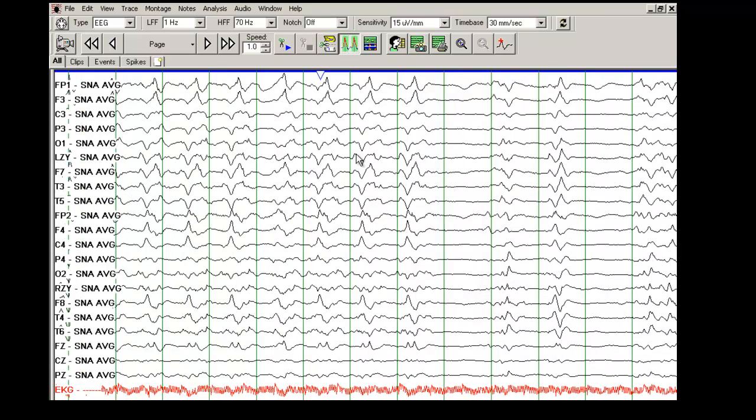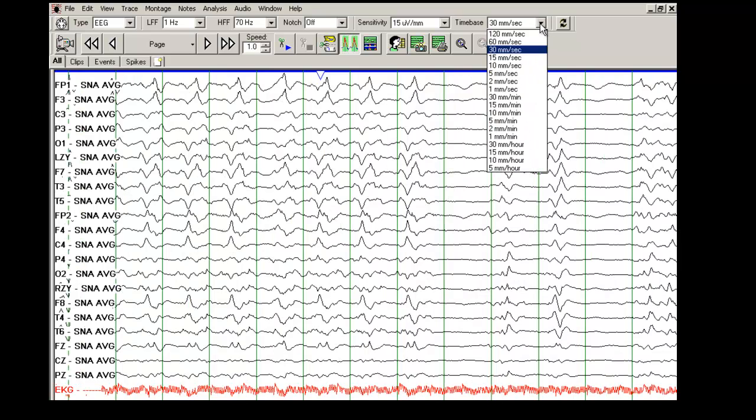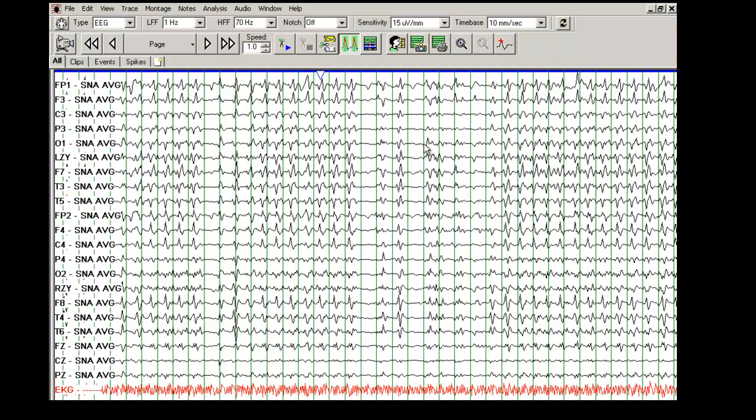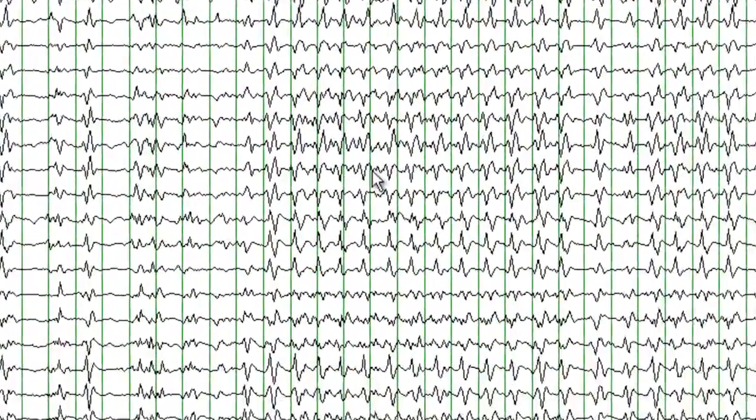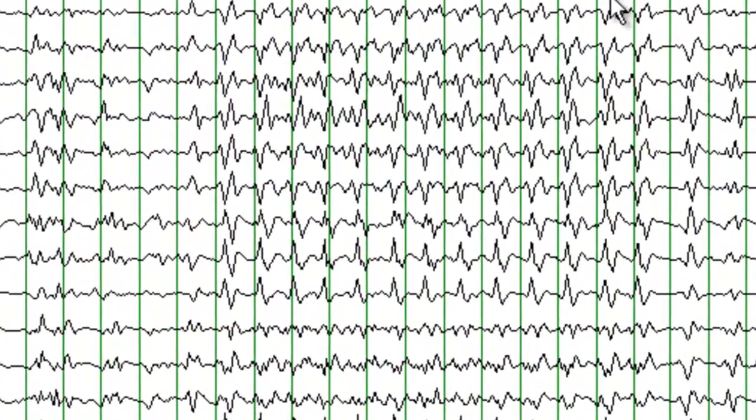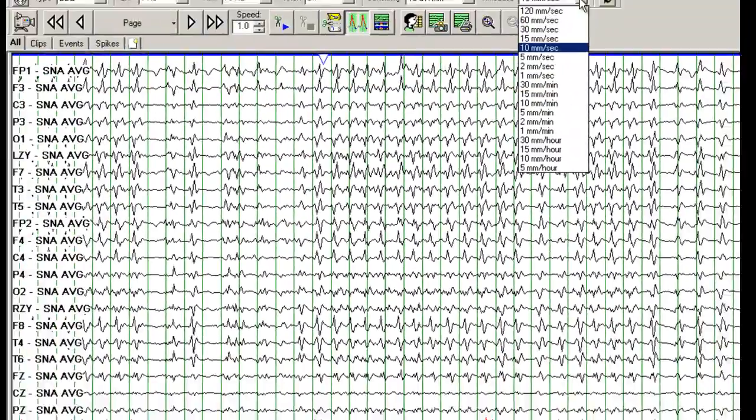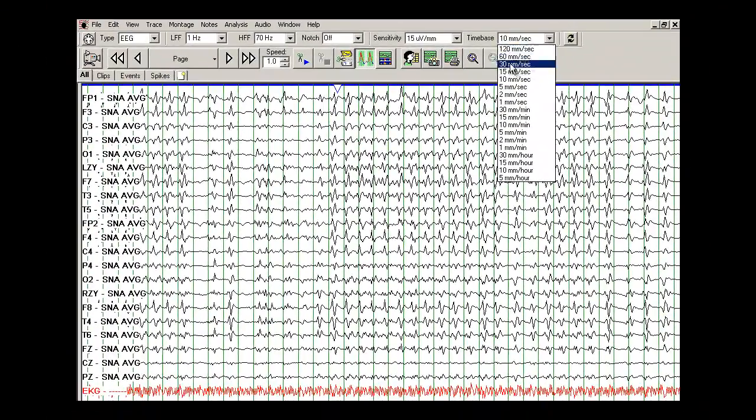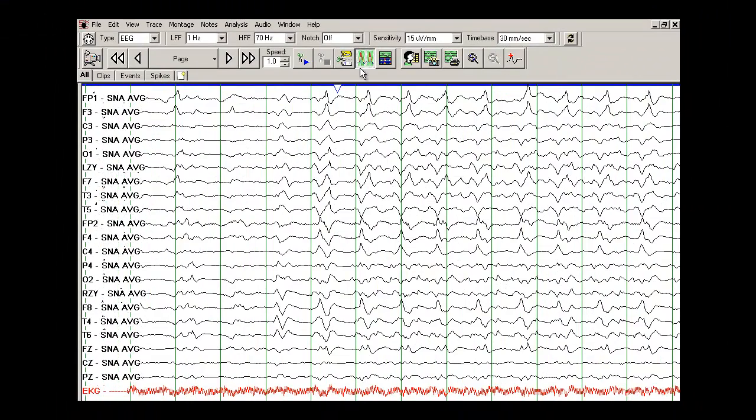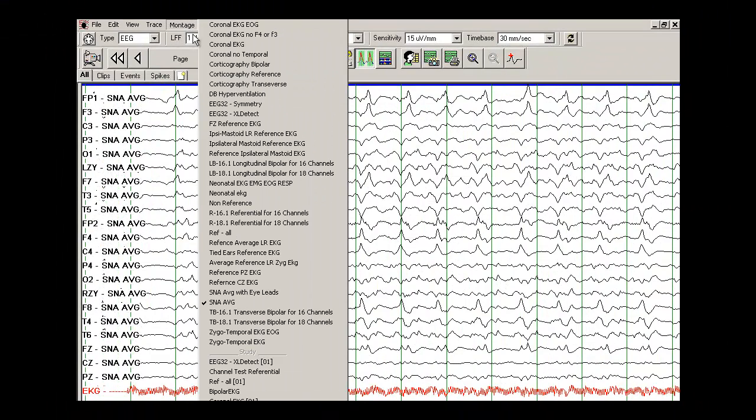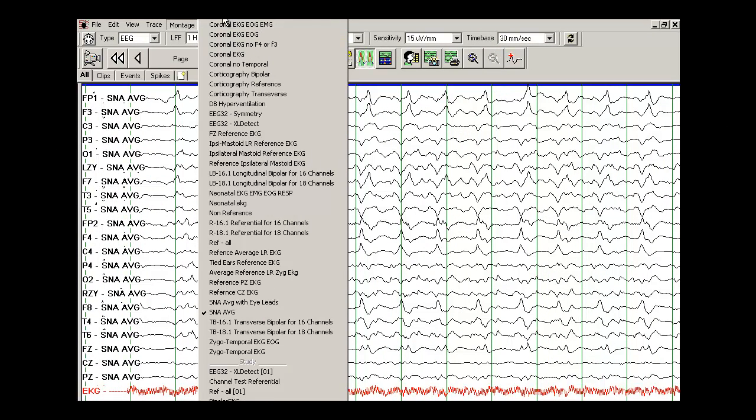And if I compress it here, I will go back and compress it. So you can again appreciate the periodicity of these discharges. Back to the bipolar montage.